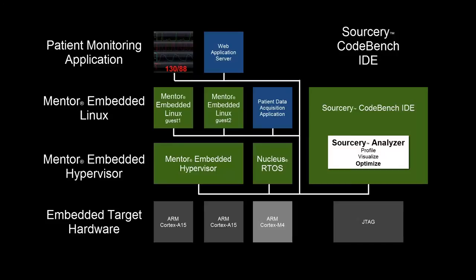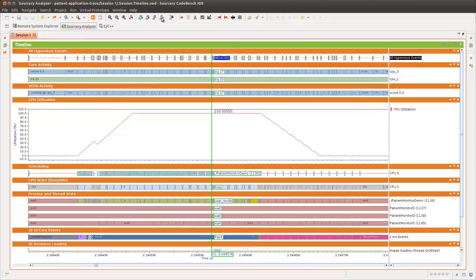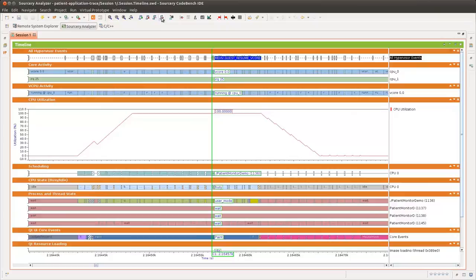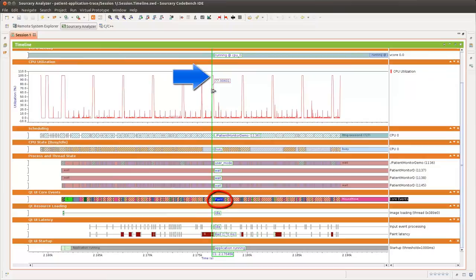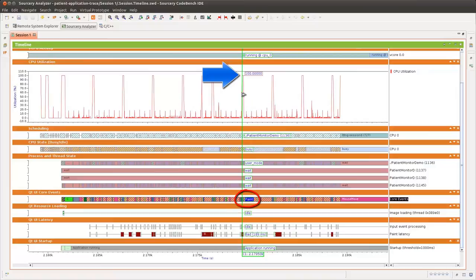Sorcery Analyzer allows us to visualize and explore our entire patient monitoring stack to gain deep insights into system and application level behavior. This profile session includes event markers and state values for the mentor embedded hypervisor, mentor embedded Linux, and Qt application layers. The x-axis represents time, and the cursor in the center of the screen includes labels indicating the state of that component at a particular point in time.